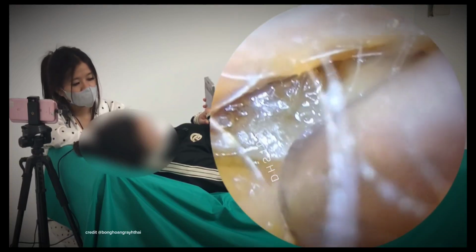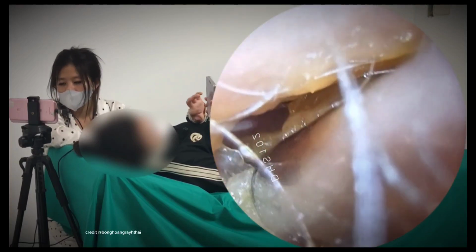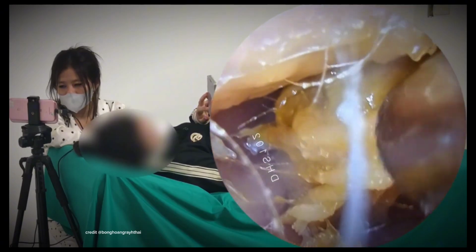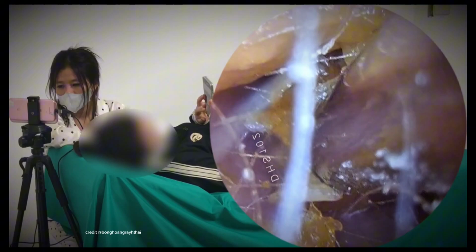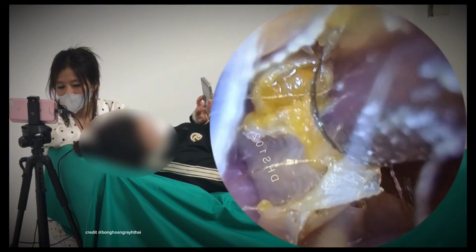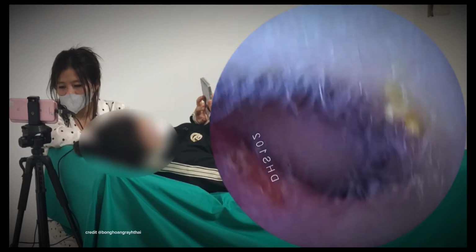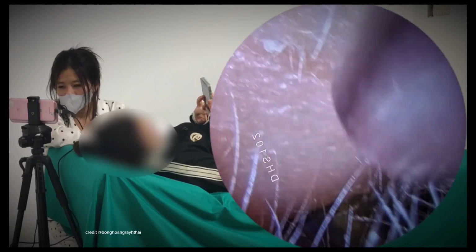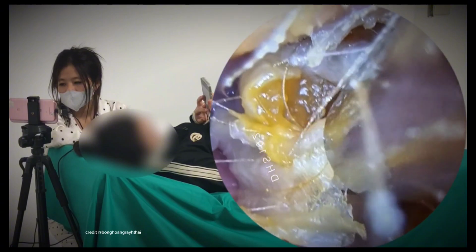We say swimmer's ear in the UK. And this is the normal ear, so this is the non-infected ear on the patient's other side. I thought I would show you the non-infected ear first, because this gives you a good idea of what's normal for the patient. So there's a little bit of redness and dry skin around the outside near the entrance to the ear canal.